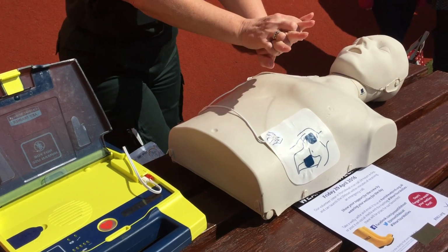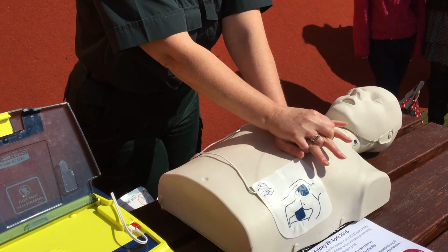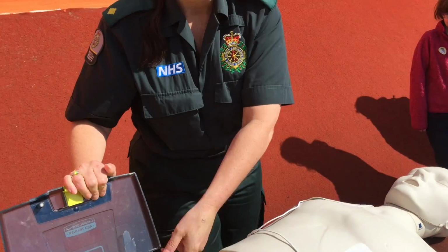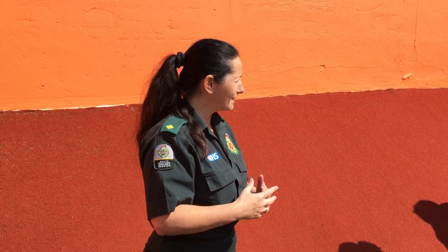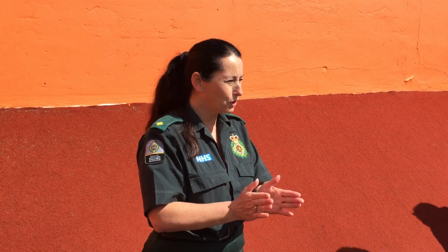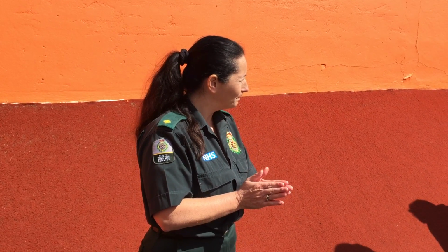So now you will be back on the chest. Start CPR again with another 2 minutes. Give 30 compressions. And you just keep going like that till the help arrives and takes over from you. So every single 2 minutes, that person could potentially need a shock.